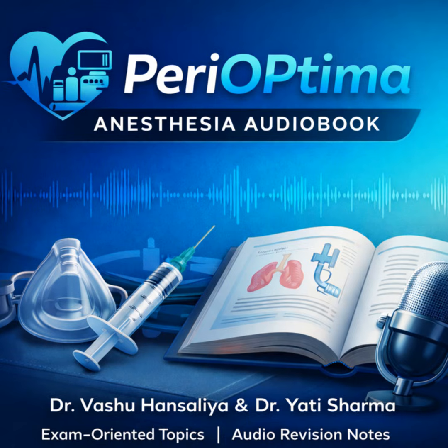And finally, the oximetry trap. Pulse oximeters have a known accuracy issue. They can potentially read up to 5% high in that critical 76% to 90% saturation range. So, to conclude, the complexity of modern anesthesia delivery just mandates a redundant, multi-layered safety strategy. It spans from passive physical indexation systems all the way to active electronic monitors. Mastery of these safeguards is crucial, not just for your exam success, but for demonstrating a fundamental commitment to patient safety in your clinical practice.